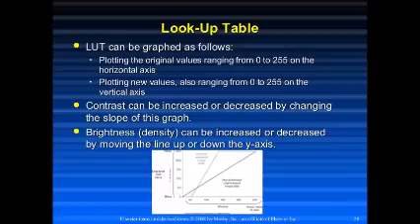After the histogram is made, the lookup table is used as a cross-reference and to transform the raw information. The LUT has a map function and all the pixels are changed to a new gray value. Images then will have an appropriate appearance in brightness and contrast.